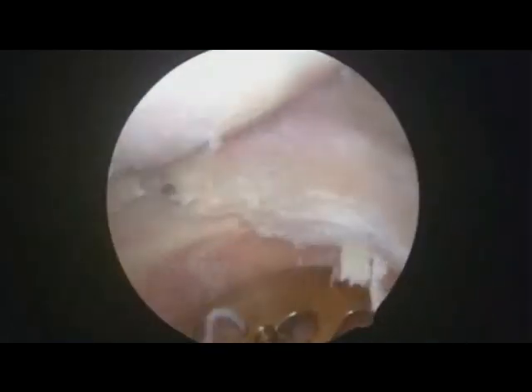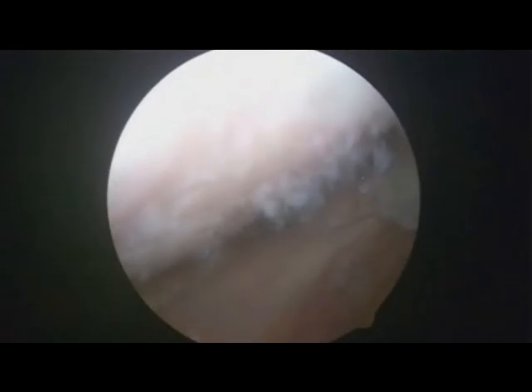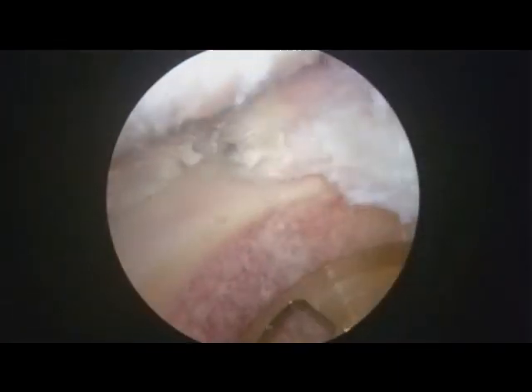So that's good. I'm happy with the height and position of that implant. So I'm just going to accept that one, and that's going to be the final one. Now at this point in time, I'm just going to clean up my joint surfaces, make sure I clean out any debris from the knee joint that may be left. Can I have a shaver, please?